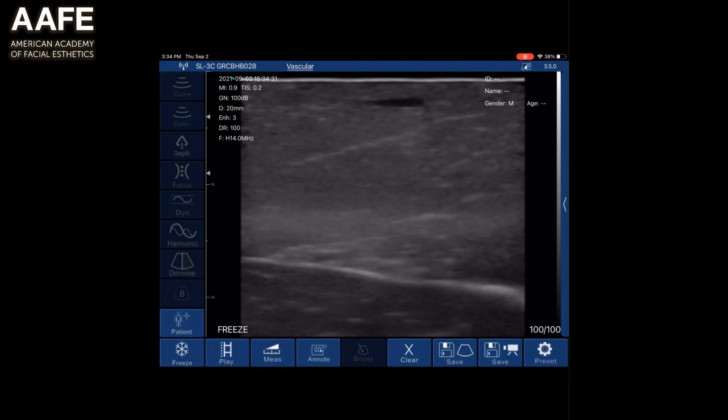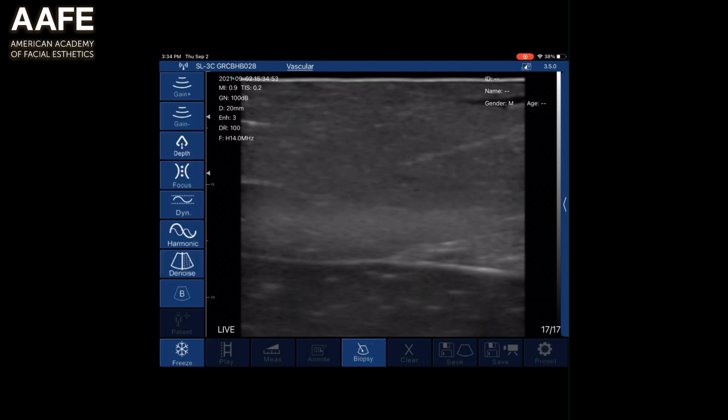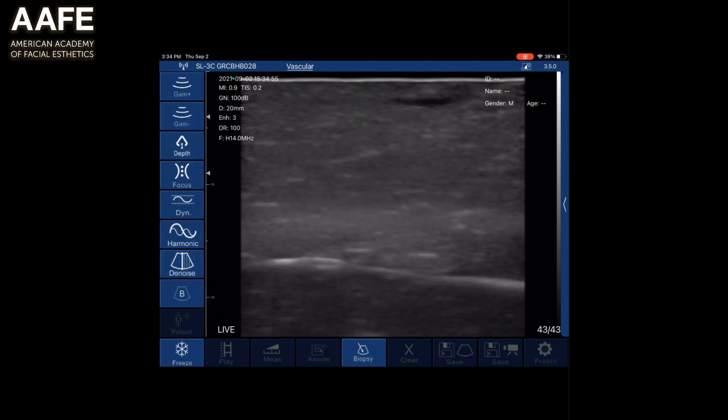And we freeze the frame. We go ahead and go to the measurement, go to length, just use your finger and go ahead and put out your measurements right there. And you can see exactly how big this area is and drag it along. Do whatever you like to go ahead and get that measurement of 1.5 to 2 millimeters in this case of that. Then you go back in and find it again.